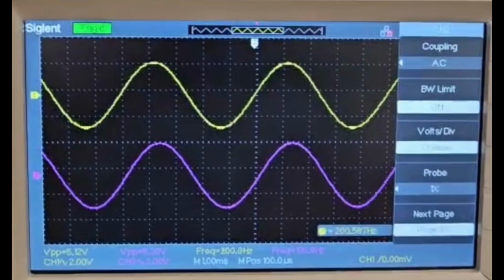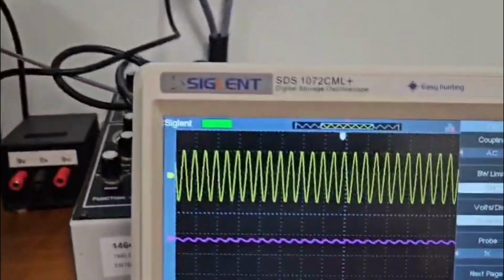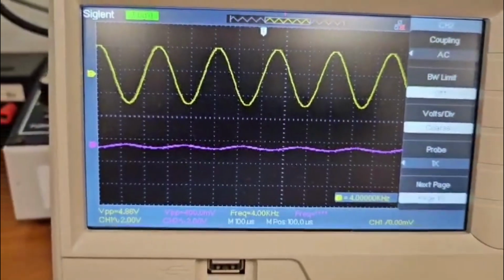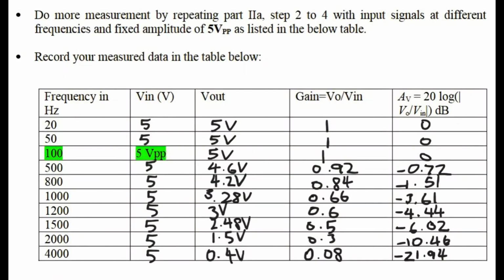And now we'll switch to 4k Hz. At 4k Hz, it shows 400 millivolts. At 4k Hz, the signal is far beyond the filter's cutoff frequency, so it's heavily attenuated, reducing the output to just 400 millivolts. So this table shows the output voltage at different input frequencies.